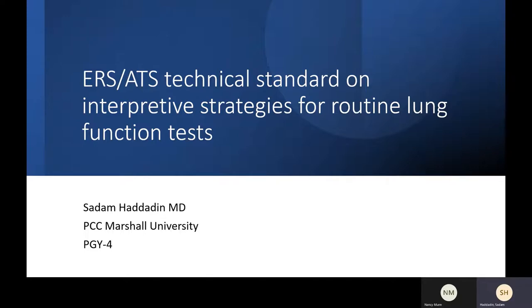I would think this is very useful. We have been talking about this, and Dr. Jasmi has been telling us this for 2 years now. You will have a patient with half a liter of FEV1, and you start him on bronchodilator, and his FEV1 goes up by 100 ml. But if this 100 ml for this patient is 20% of his breath, when you do the numbers, he's a non-responder.